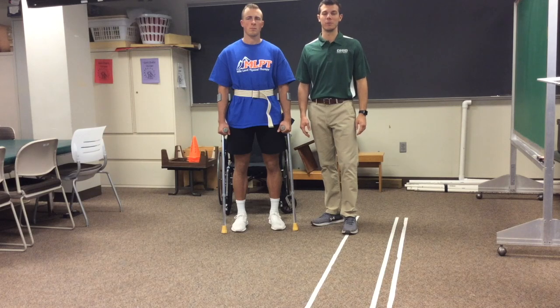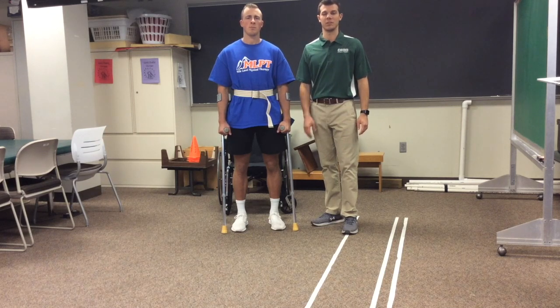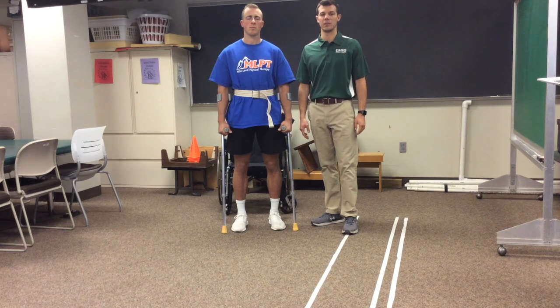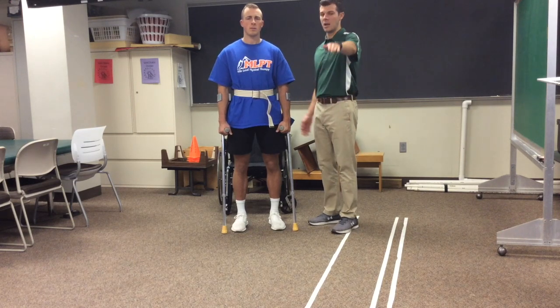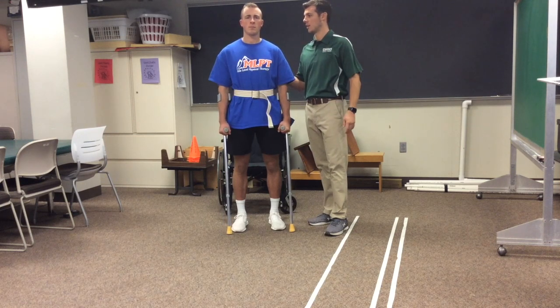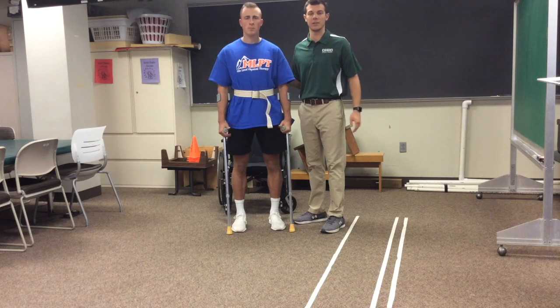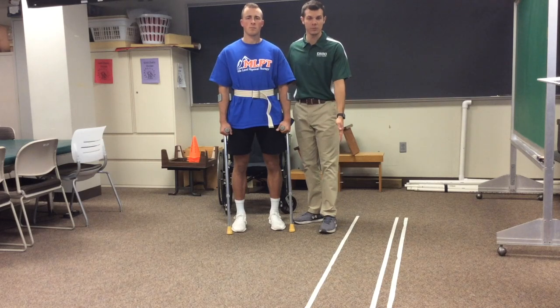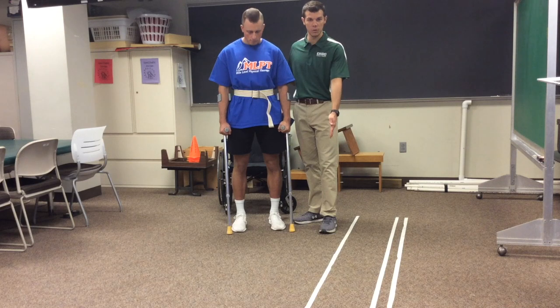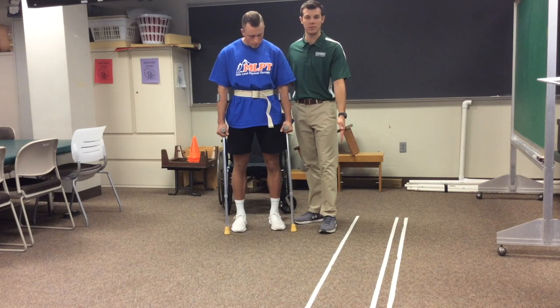Now we're ready to have Josh do the four-point gait pattern. Recall the proper positioning of the patient and yourself, the therapist. For the patient, we want to maintain upright posture, forward gaze, and also feet standing shoulder-width apart to provide good stability. The Lofstrand crutches should be placed a little forward and lateral to the patient's fifth metatarsal.